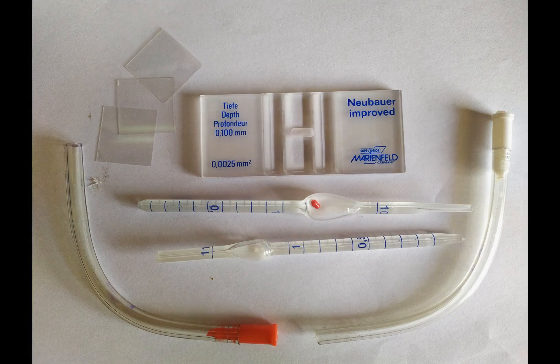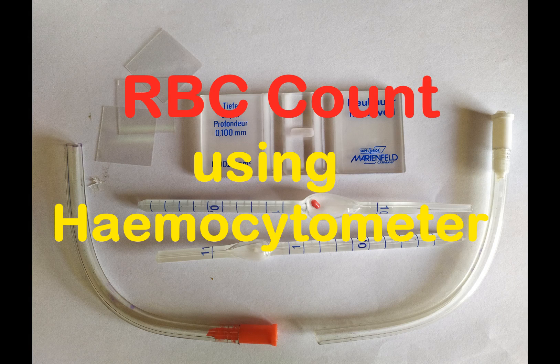In a previous video, we talked about the components of a hemocytometer and what it's used for. In this video, we're going to count the number of red blood cells in a sample of human blood using the hemocytometer.